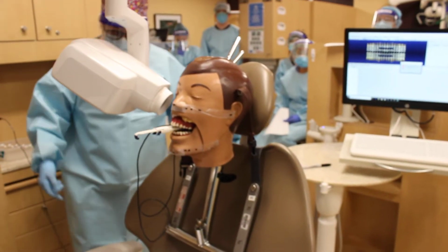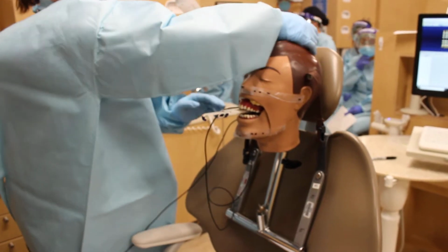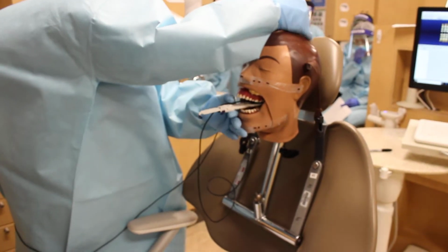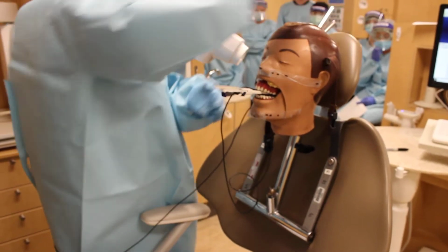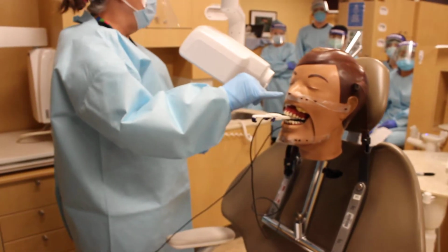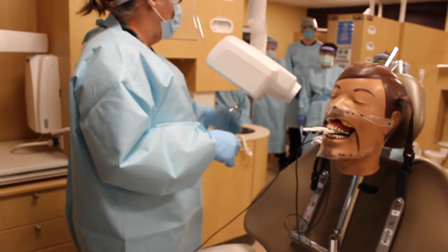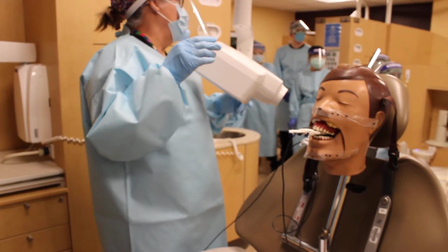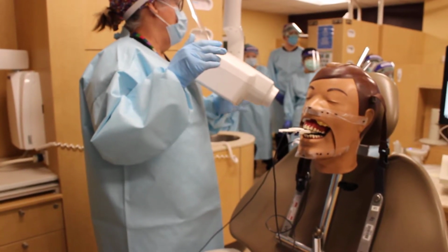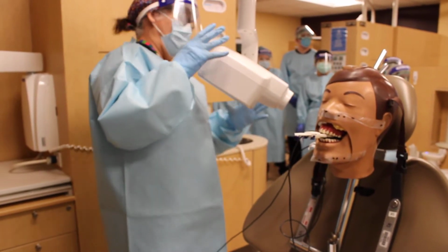Now it's telling me to go to the premolar. So I'm going to have it open a little bit. I'm going to move it a little forward. Now I'm going to go to the inner canthus, between the ala and the tragus. So that's my second dot. What's my angulation? Pass it to the next person. The premolar? Maxillary premolar. 35? 45? 30 to 40.